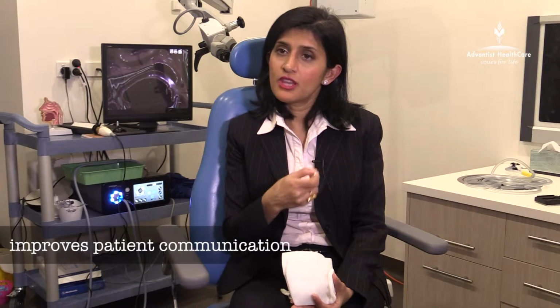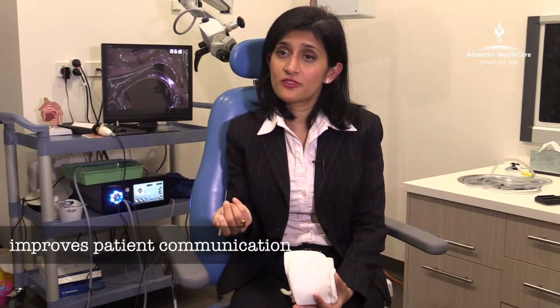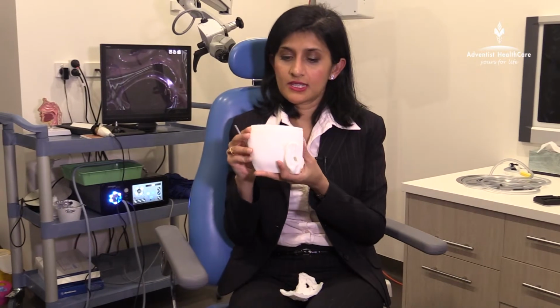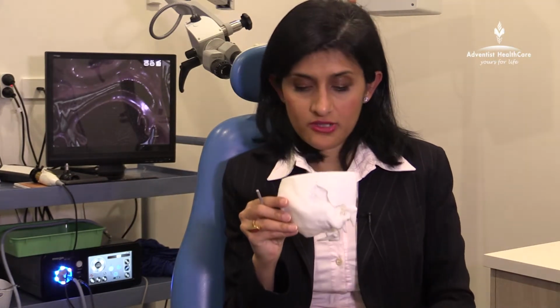To be able to take a normal patient's scan, to 3D print their bone or a bone, and show to them in real life on a plastic model what the surgery is going to involve really helps cross some communication barriers. For example, this is a print that I've done of a patient's ear, and it's great because we've been able to print not just the skin, we've also been able to segment out the bone and print the bone separately, on which I've done cochlear implant surgery.